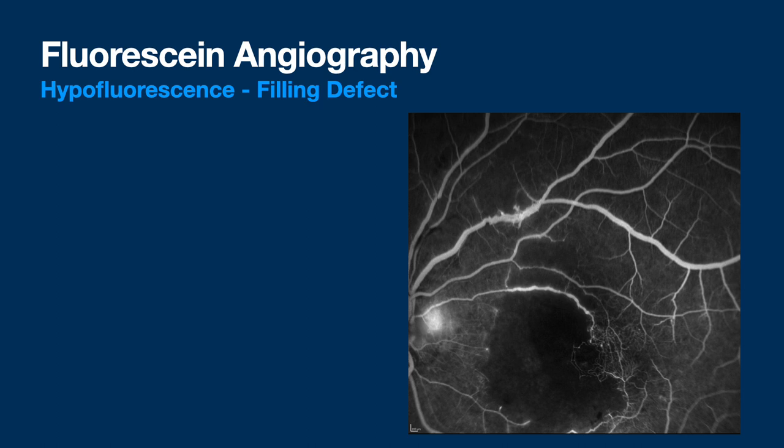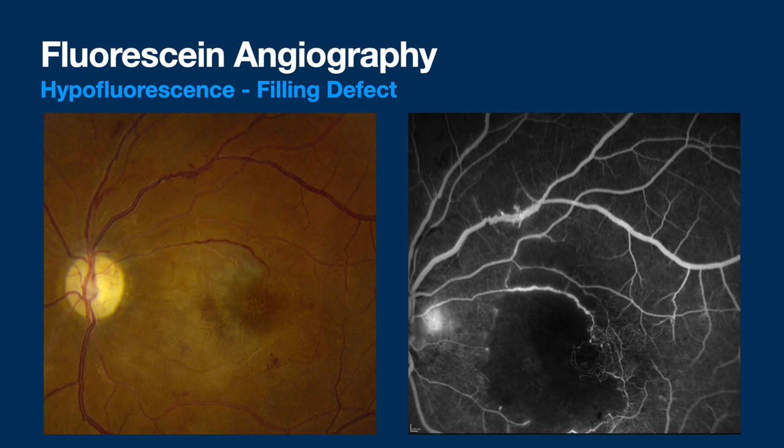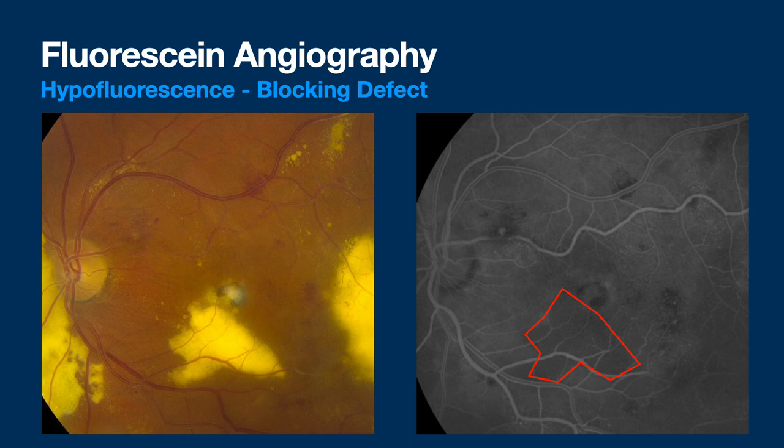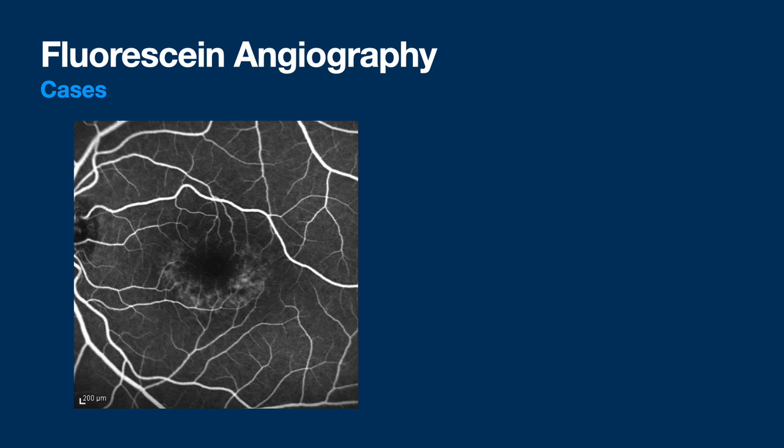Here's a filling defect — you can see a parafoveal ring of capillaries but then a large area where there are simply no blood vessels, representing non-perfusion. And here's a blocking defect — it's a patient with Coats disease and a lot of hard exudates blocking choroidal fluorescence.